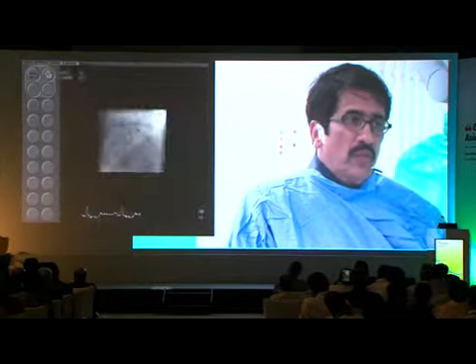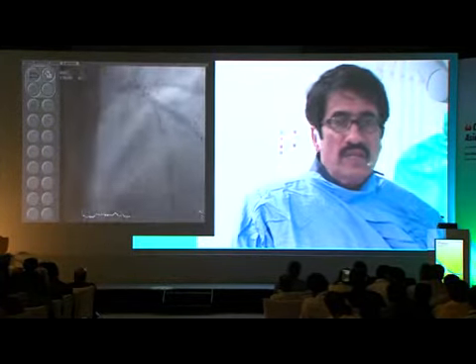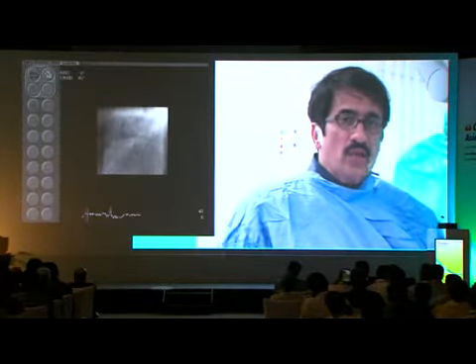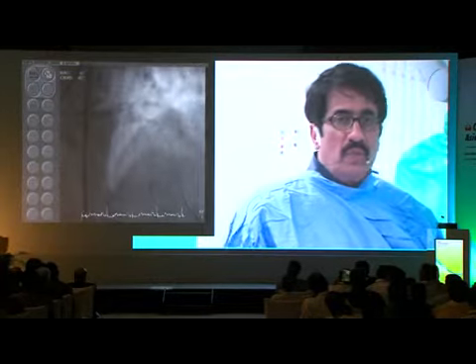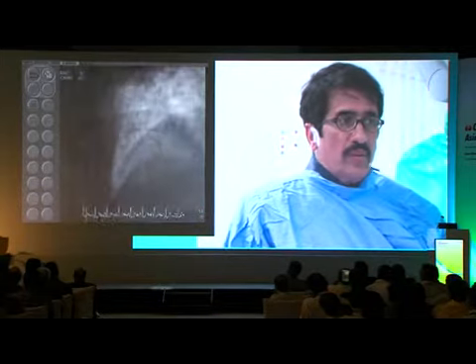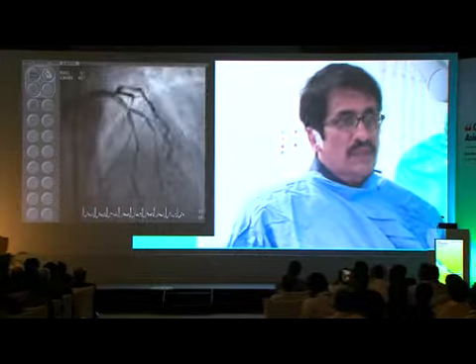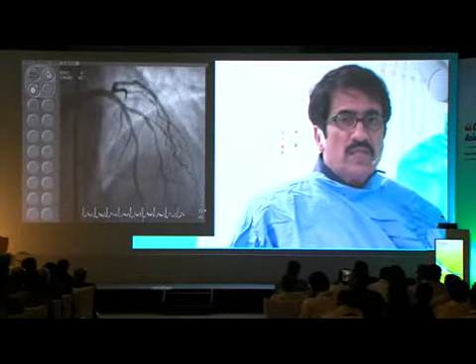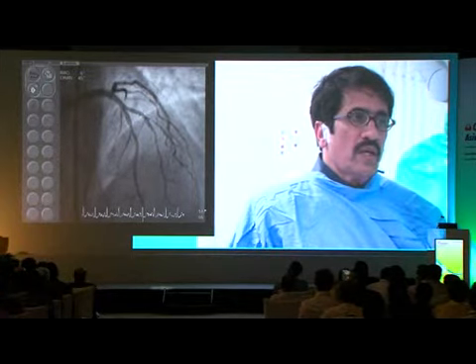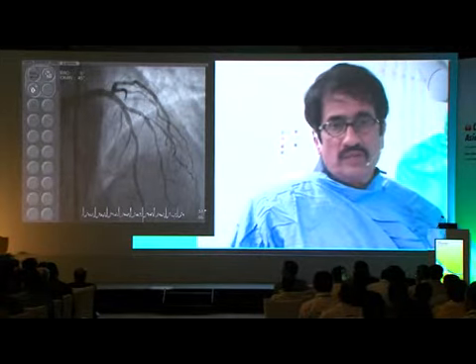And my feeling was he was asking for it. So it's not that you see a diagonal lesion and you go for that lesion when the LAD lesion is not critical. The LAD lesion had to be addressed only because we were addressing the diagonal. On its own, I agree that the LAD lesion probably didn't need addressing. But I was very convinced that it is a critical stenosis. Now this is the price we are all going to pay if we want to perfect the result. So IVUS and 2 drug stents are all part and parcel of getting over the problem.